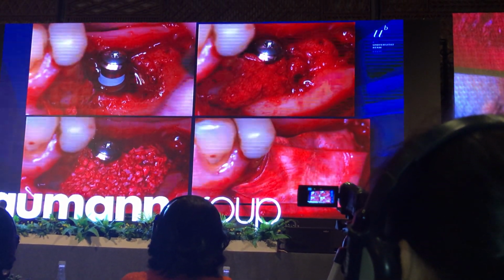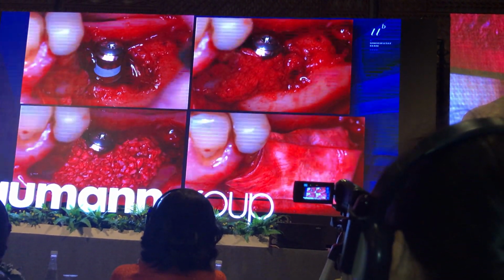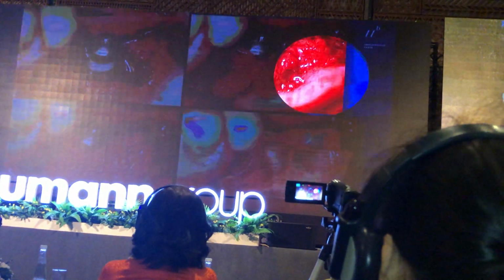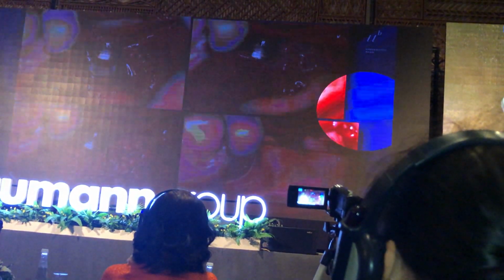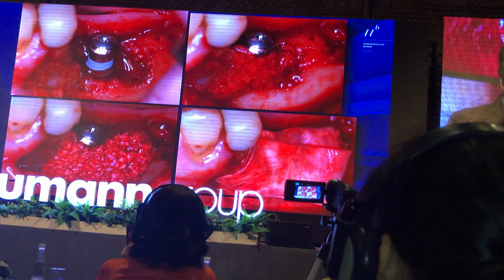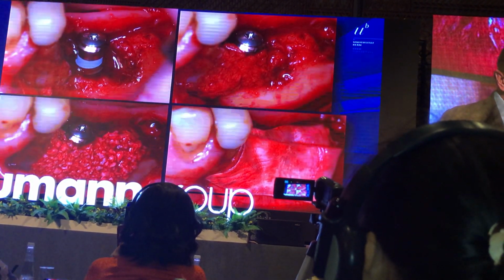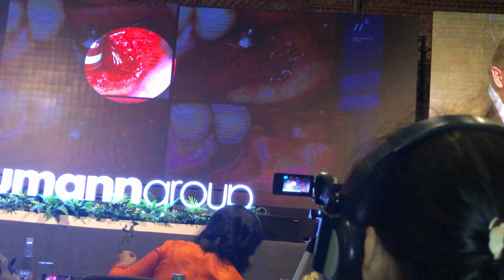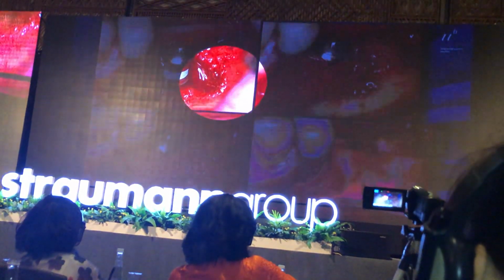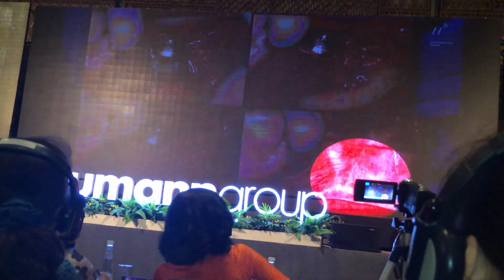So we take a lot of bone. And of course, where do we take the bone? We take the bone from here. Take the bone, retromolar, and move it a centimeter. Very easy. And then we fill up that defect. It needs to have a horizontal component here, a balcony. Otherwise, it's going to glide. And then a second layer of Bio-Oss, and then the membrane.